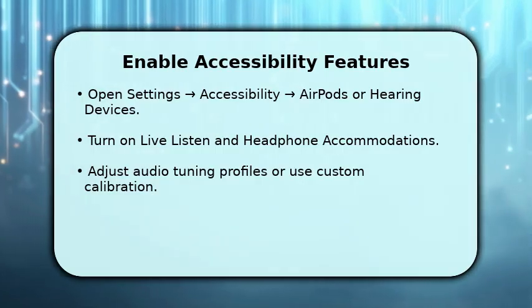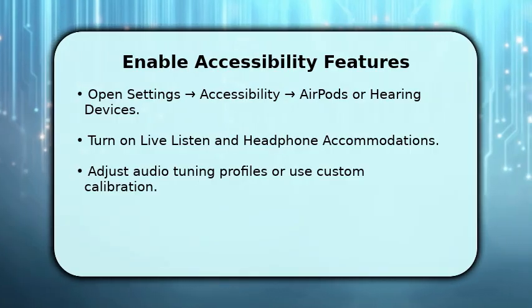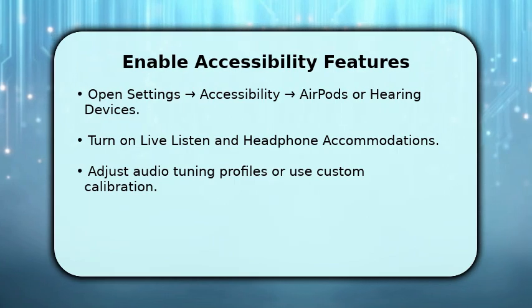Enable headphone accommodations to boost soft sounds and tailor frequencies. Choose a preset or run custom calibration. Make sure your AirPods remain the selected output. Finish by testing in real conditions.